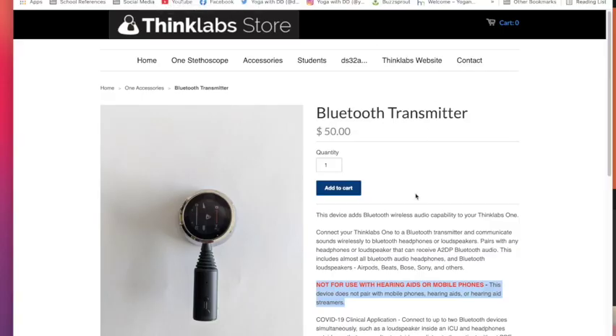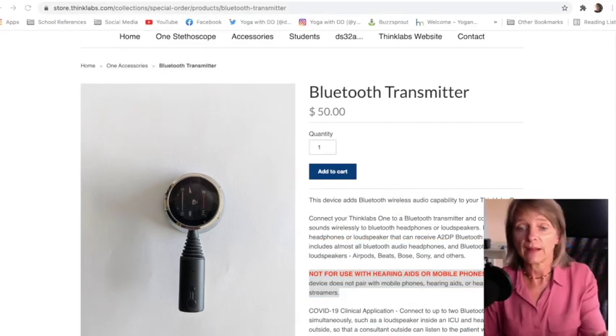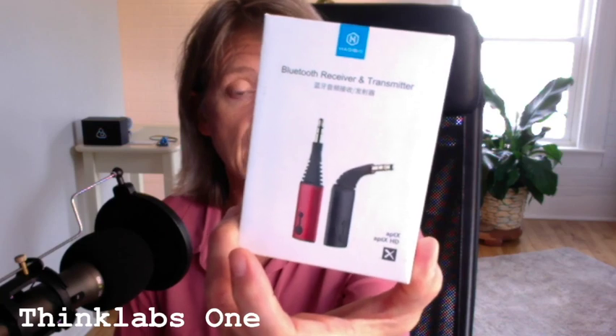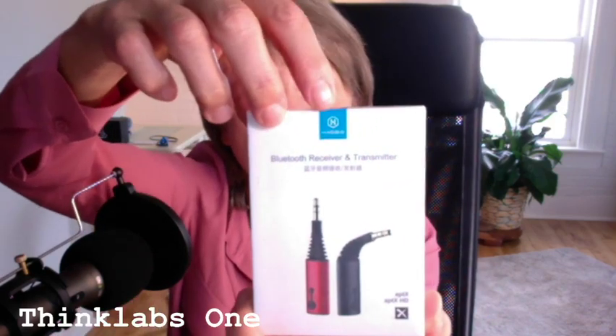Let's go ahead and show you the actual adapter — it's called the Hagibus. Let me go full screen so you can see how big it is compared to my hand. This is the box it came with, and you can see it has a red one and a black one. I got the black one — I would have preferred the red one. The logo right up here says Hagibus.